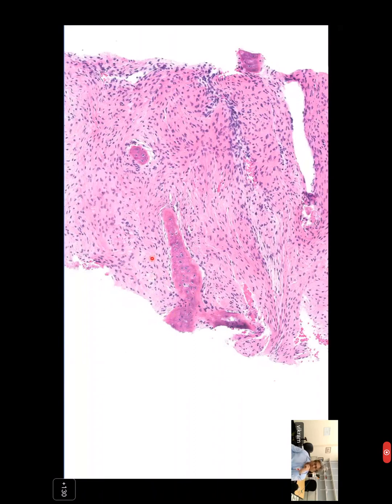Is there anything malignant that you might consider? So the only malignant thing, maybe a low-grade fibrosarcoma. Well, there's bone formation, right? So it would be a low-grade osteosarcoma, correct? Right. So there is a low-grade intramedullary osteosarcoma that you could potentially see. I've never seen a low-grade osteosarcoma this low-grade. Typically you'll have some level of atypia. The radiologist will give you a sense that they're probably dealing with an aggressive process. And this age would be an unusual one for a low-grade central osteosarcoma.